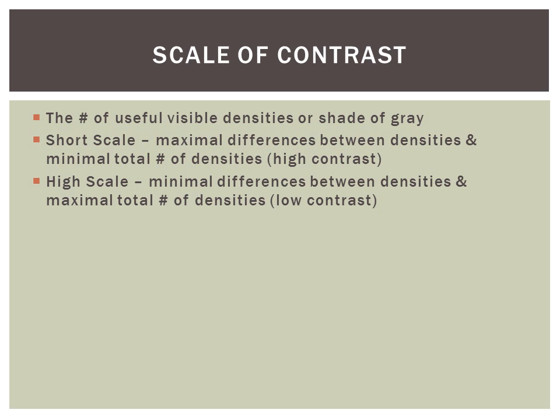Scale of contrast. This is usually a pretty hard concept to grasp. It is the number of useful visible densities, or shades of gray.